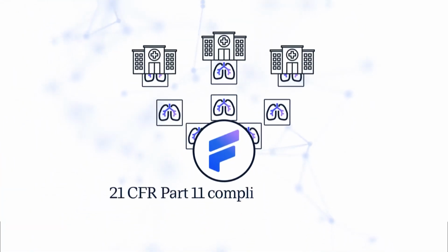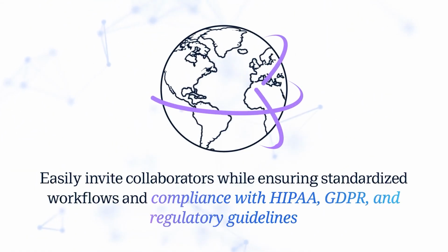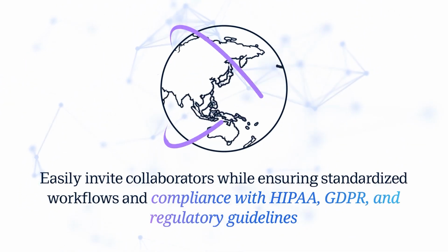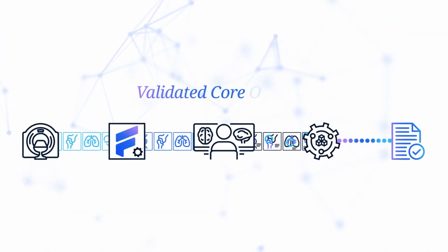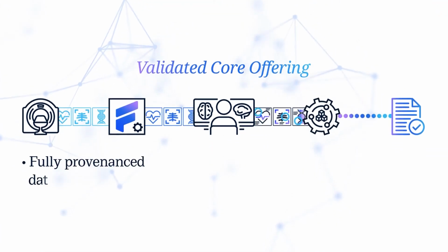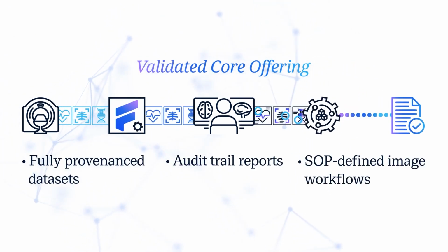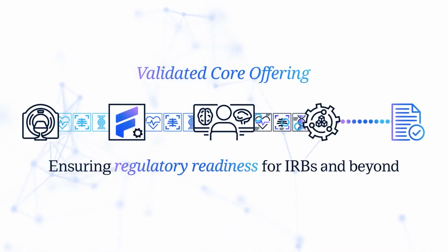Flywheel offers a 21 CFR Part 11 compliant platform designed for secure collaboration. Easily invite collaborators while ensuring standardized workflows and compliance with HIPAA, GDPR, and regulatory guidelines. By using our validated core offering, you get fully provenanced datasets, audit trail reports, and SOP-defined image workflows, ensuring regulatory readiness for IRBs and beyond.